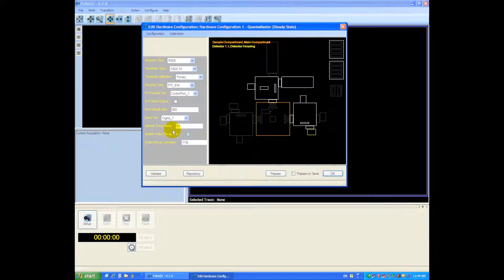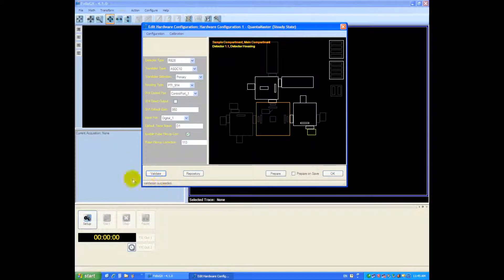Next thing we can do is validate the configuration and if we've made any mistakes you can see down here it'll show up. If we forgot something it'll remind us to change some settings.